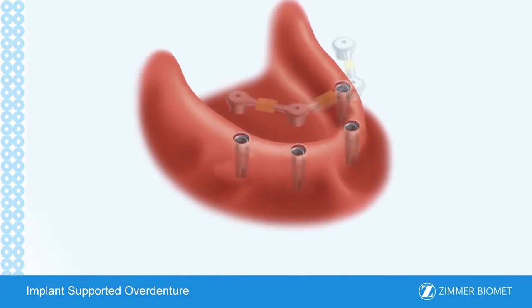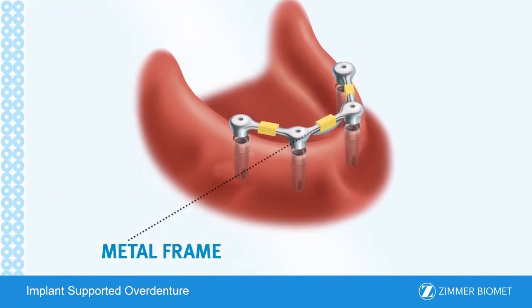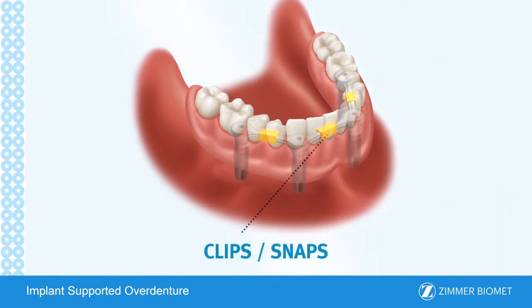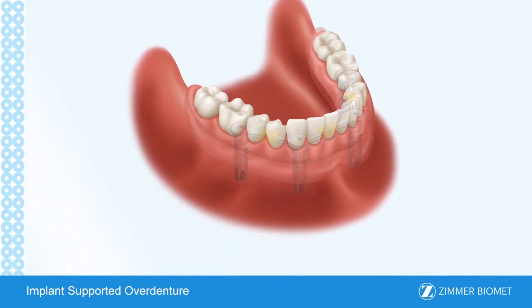Following healing, the implants are uncovered and a custom metal framework manufactured by a dental laboratory is screwed onto the abutments by the dentist. An overdenture is then placed on top of the metal frame. This denture fits over the restoration and attaches to it with clips or snaps. These clips and/or snaps make the overdenture more stable and enable it to stay fixed in place better than a conventional denture. They also make it easy to remove for at-home cleaning.